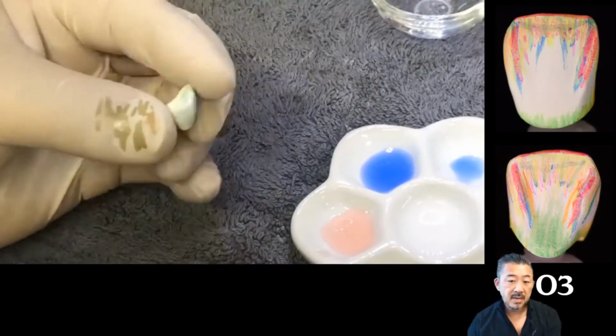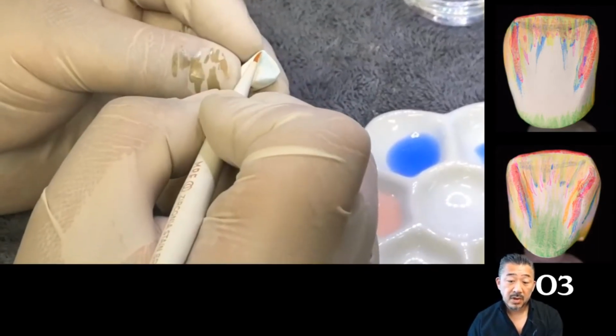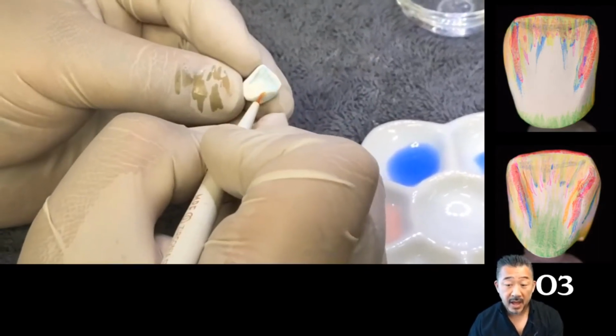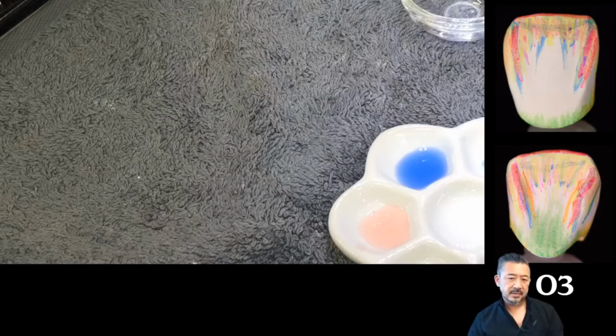The steps are much simpler and easier than using the TT white, because you don't have to use the blue, the gray, or body color in the first step, right? But if you really need to use a TT white disc, for example for a long span bridge, you need to know all the steps. That's what I say.